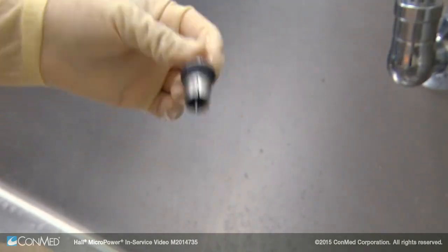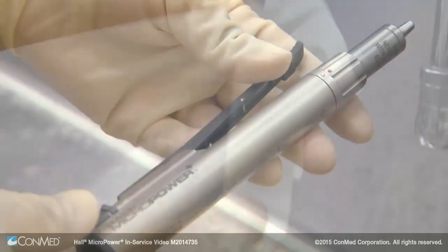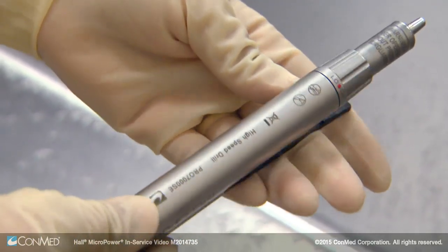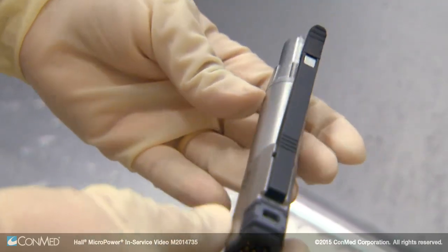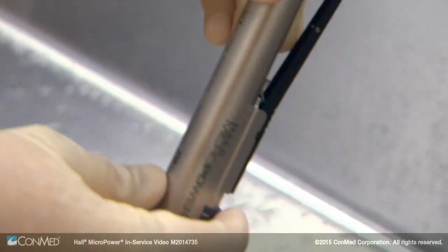Gently shake the equipment free of water and wipe the surfaces with a clean lint-free towel. Dry the contacts thoroughly to prevent corrosion. Prior to sterilization, visually inspect the handpieces and accessories under good lighting conditions to check for visible soil and corrosion.